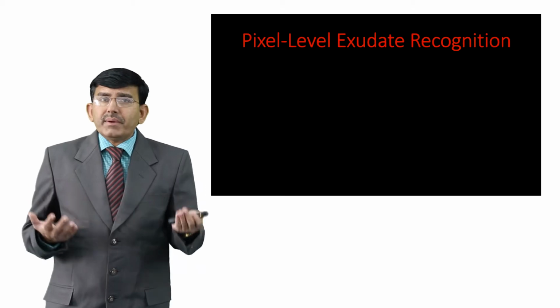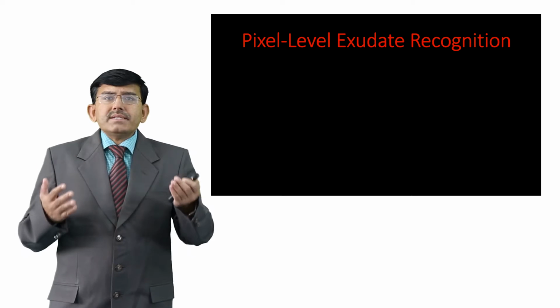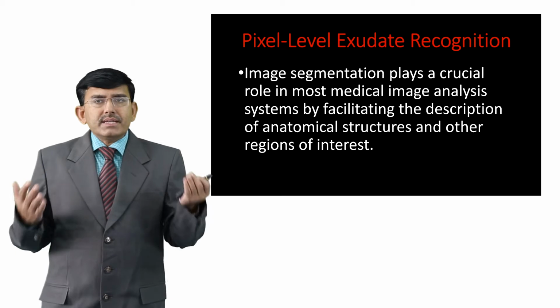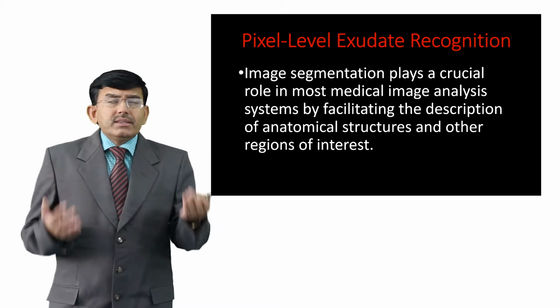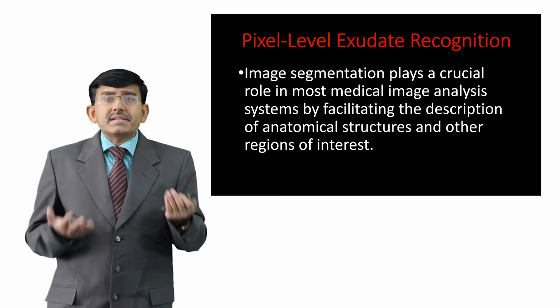Our next topic is pixel level exudate recognition. Image segmentation plays a crucial role in most medical image analysis systems by facilitating the description of anatomical structures, and other regions of interest of the images are prominently highlighted.